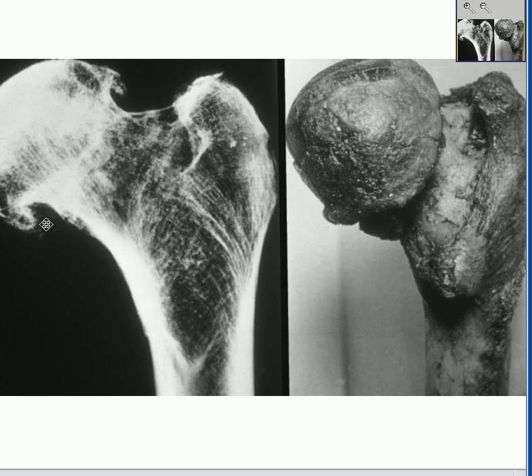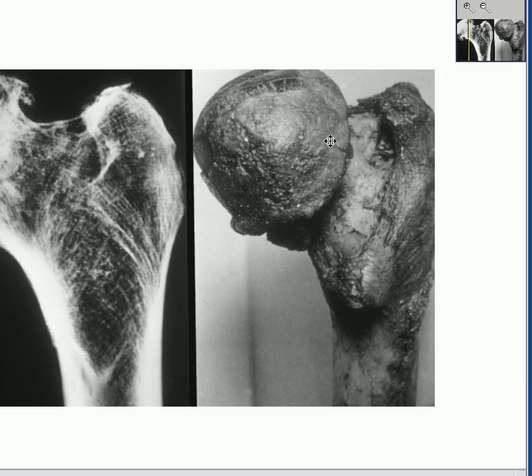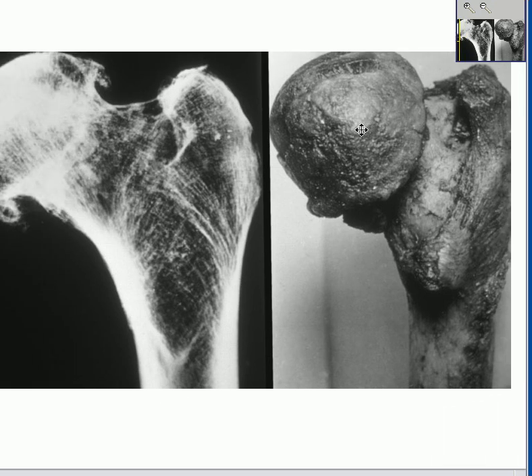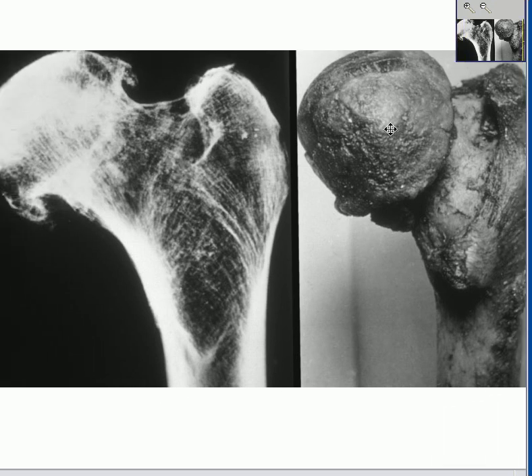On the X-ray, you can see that the cartilaginous surface has a little bit of a lip on it. These prominent lips are called osteophytes — here you see an osteophyte radiologically, and here you see osteophytes on the gross specimen of the bone. So the three questions raised in this slide are hopefully now answered. Thank you very much.